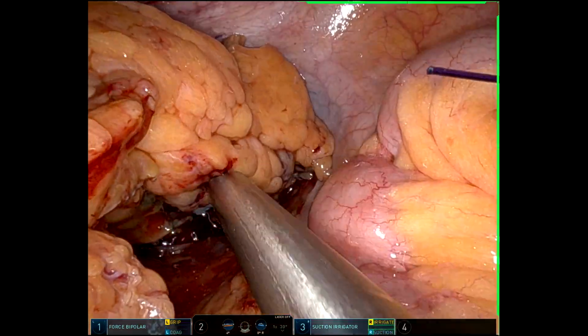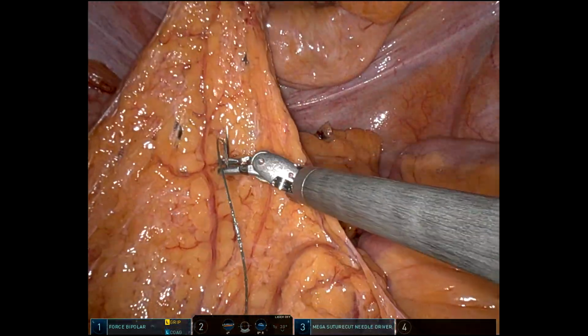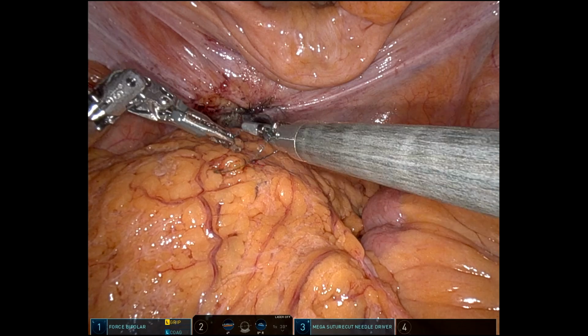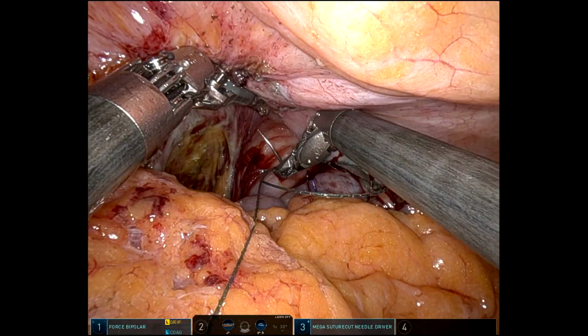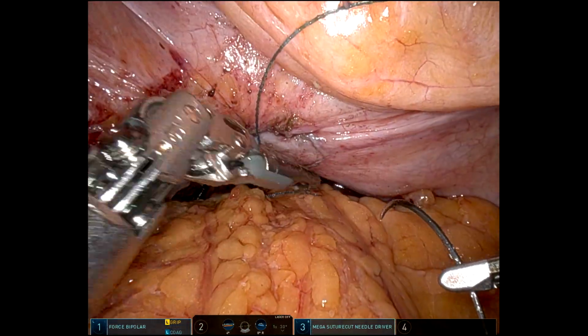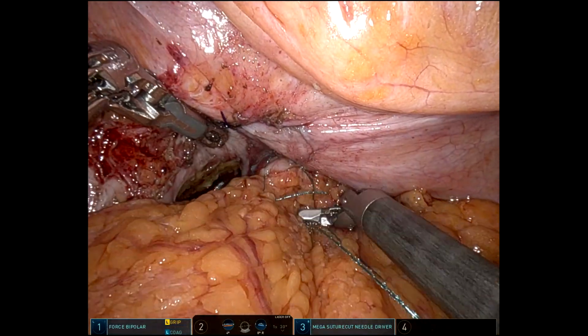I like to interpose the fistula site to the anastomosis, much the same if I do a transvaginal extraction. I like to oppose that from the suture line, and when the omentum reaches rather easily, I'm just going to use that. So I had some extra V-Loc here from the bladder repair, and I'm just sewing a flap of omentum down into the deep pelvis. I did not need to mobilize this off the transverse colon. It kind of just went on its own.